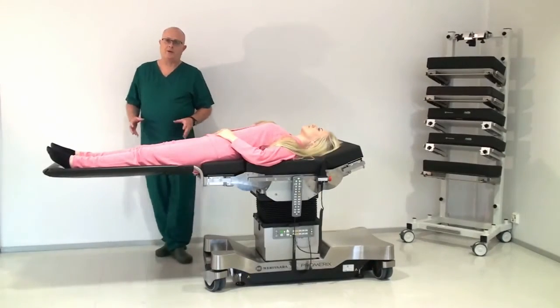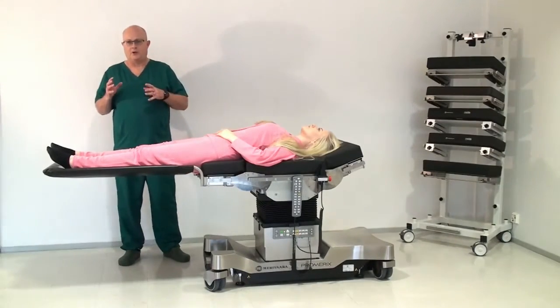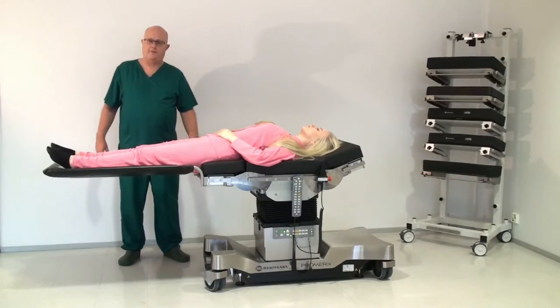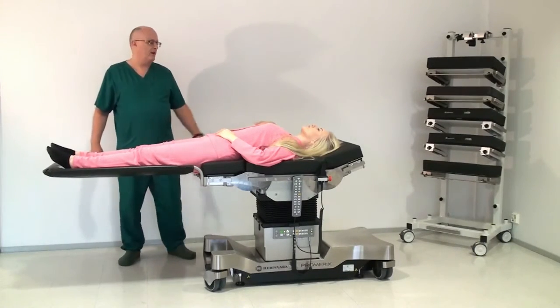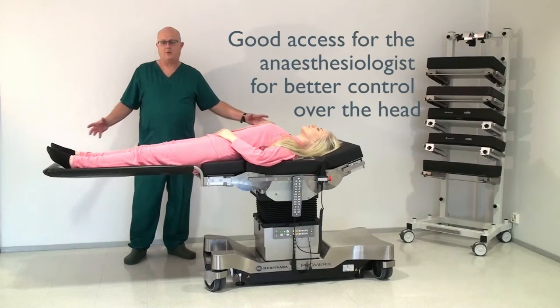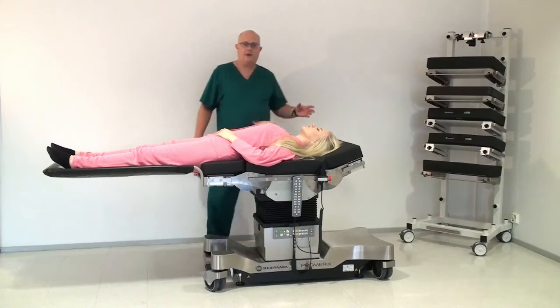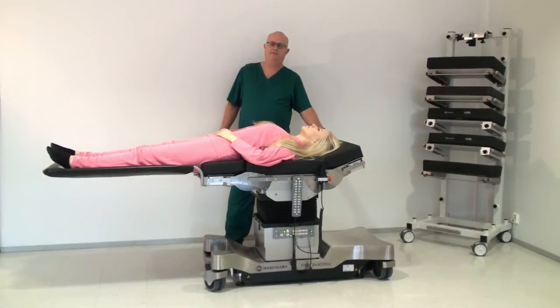Okay, this is the table set up with 25 sections on it instead of 40 sections. So a short 25 bottom section and a short 25 upper section. It takes quite a lot of the size off of the table, and it gives the opportunity for the anaesthetist to have more control over it.